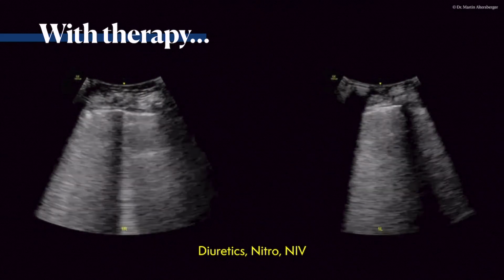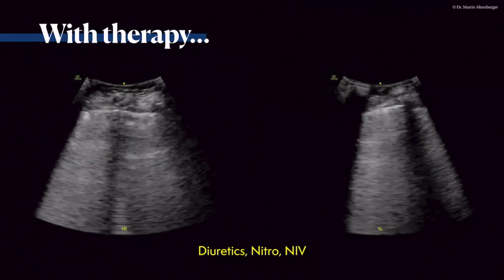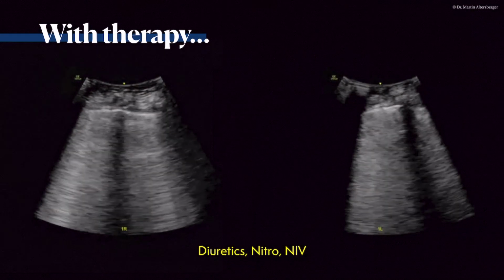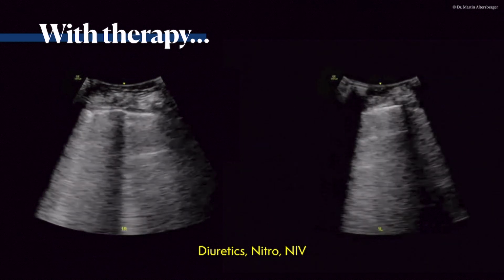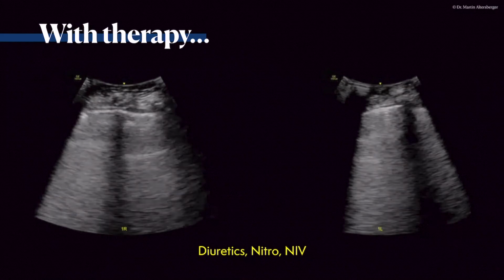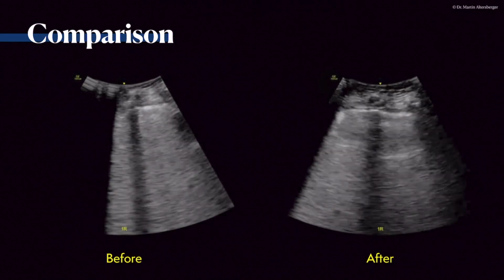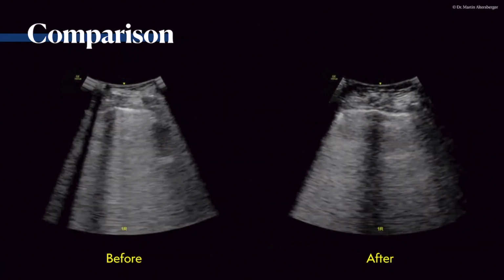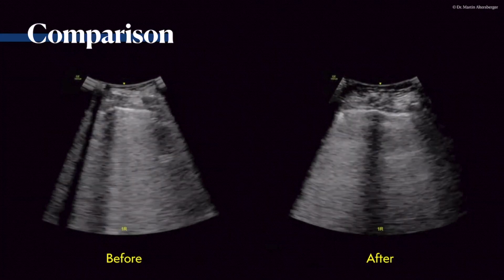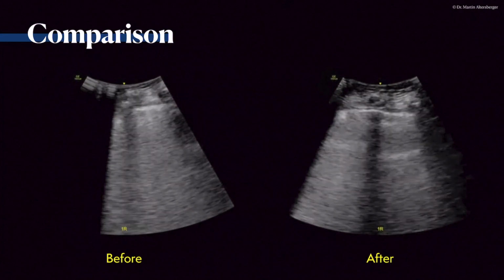The same is on the left side, you see it over here, you see A-lines and definitely fewer B-lines. And our patient was feeling much better just briefly after we initiated therapy. So comparing before and after, this is before treatment, this is after treatment. Here you have plenty of B-lines, here you have singular B-lines.